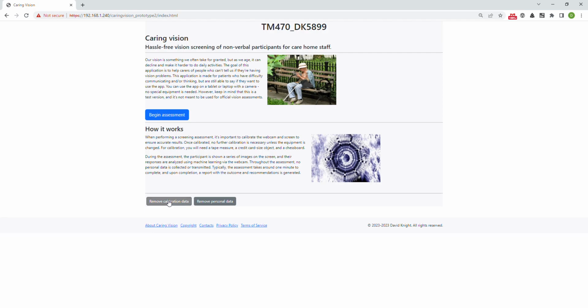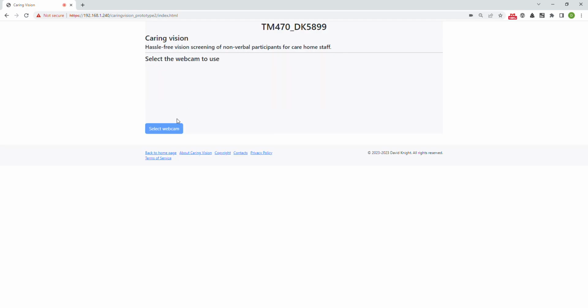So we're going to go ahead and remove the data on the system. So I'm going to remove the calibration data and also any personal data. Now at this point in time there is no data on the system, so we're going to have to replace it. So we're going to start the assessment. And the first screen, of course, is going to ask you which webcam you want to use. On this particular laptop that I'm using, there is only one system, this HD camera, so we're going to click on that, and there I am. So that's the camera that I'm going to use for this assessment.